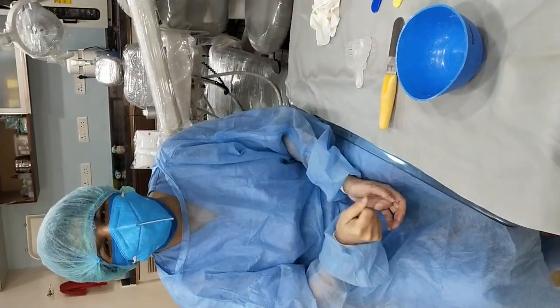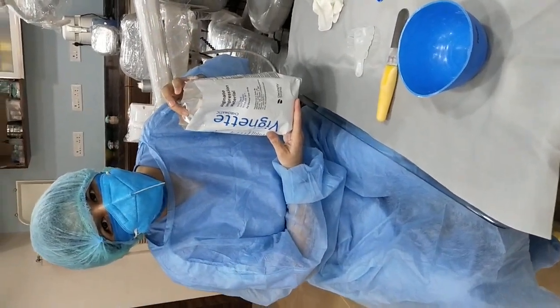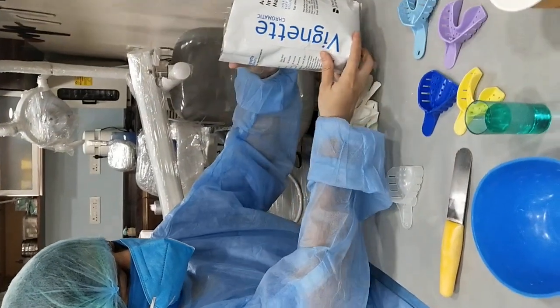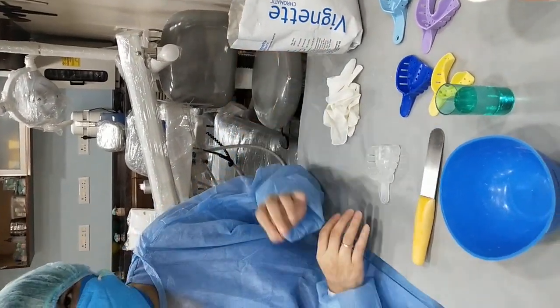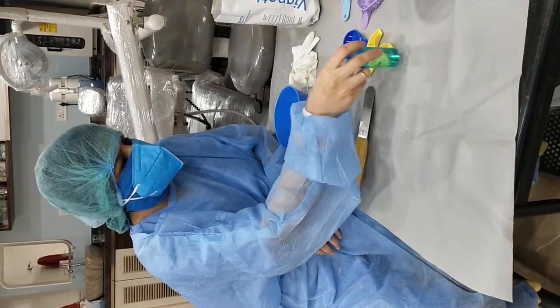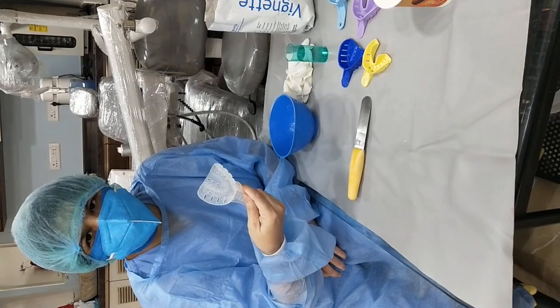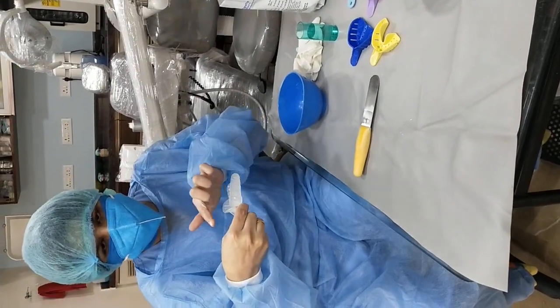There are various types of materials available for impression making, but we have chosen the alginate impression material. Before we look at the material again, let us first select the tray for it. We have picked up an autoclaveable plastic tray that covers the entire sulcus of the mouth.